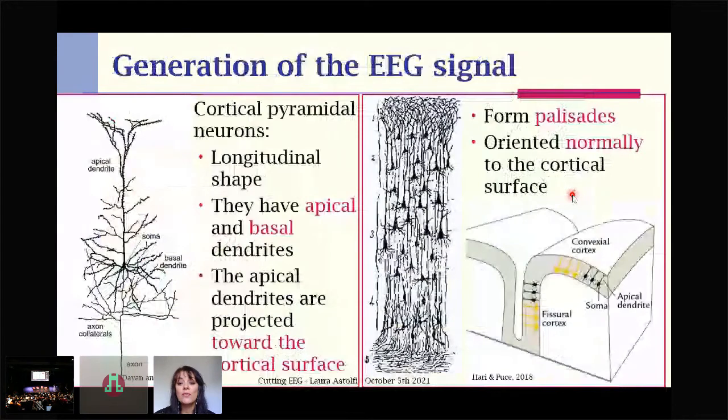The origins of EEG were already discussed very nicely by John. I will just shortly go to the dipole model. Today we agree basically that the main contributors to the EEG scalp signals are the pyramidal neurons, which extend longitudinally in the cortex, and they have some properties which make them the best sources of scalp potentials that we can record non-invasively.